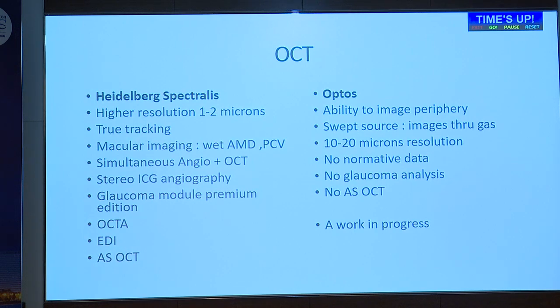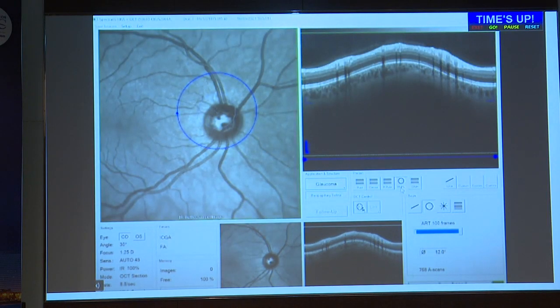They are still not standardized for glaucoma imaging. They don't have OCTA. So simultaneous angio and OCT, stereo ICG angiography, glaucoma module, all these things are not available with the Optos as of now, but I think it's just a matter of time. It's a work in progress, and they will have good imaging.